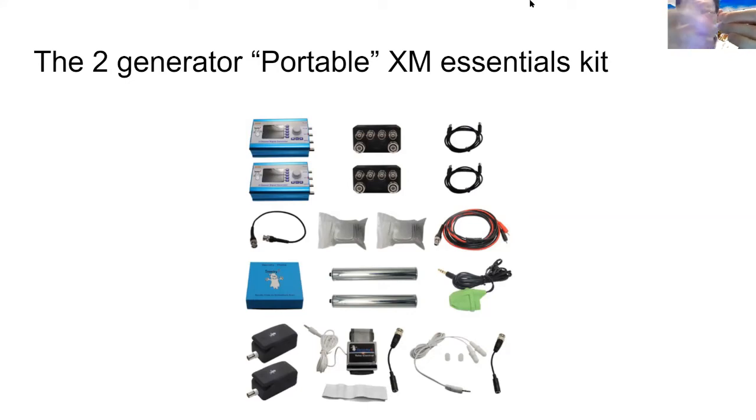So it goes around there. That's why you can still see there's some whites there from where I put the microporous tape. So that makes it less likely that the needle will come out or the pad will come off. Okay, useful technique. Go to the chemist, get some microporous tape. It's not completely infallible. Okay, it can still fail.